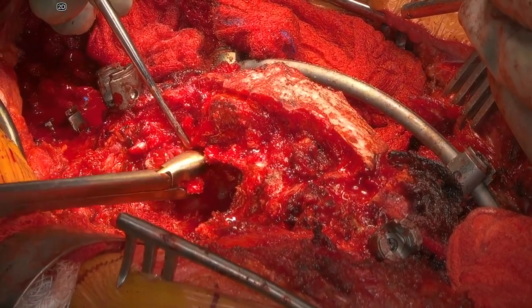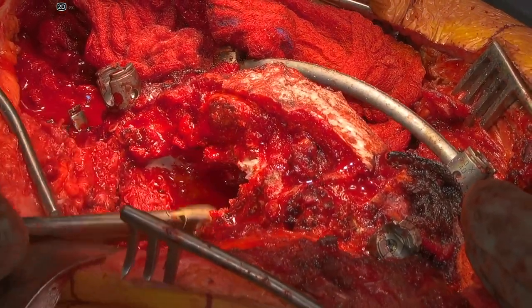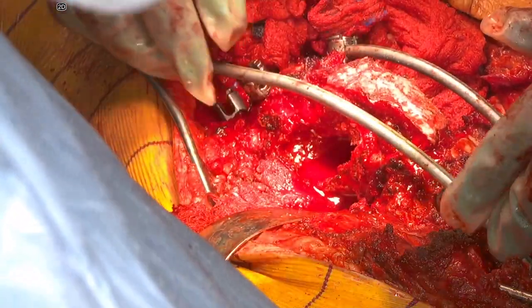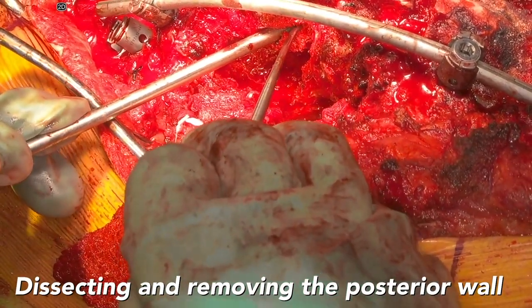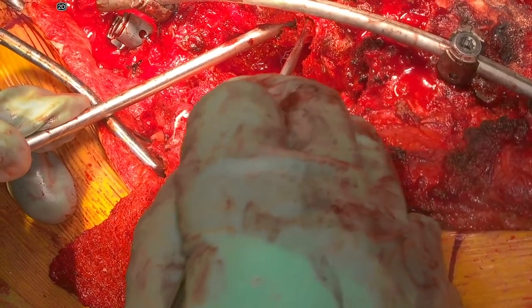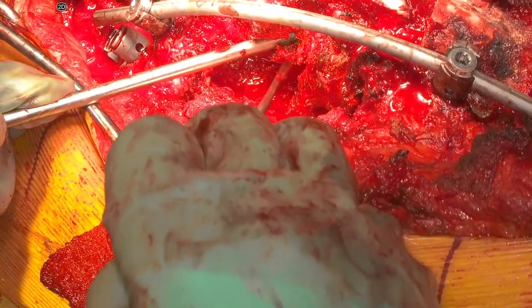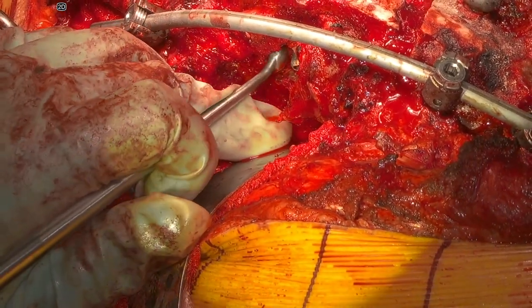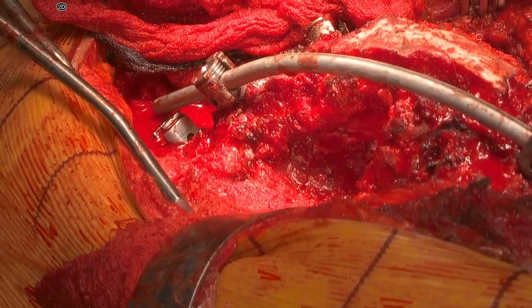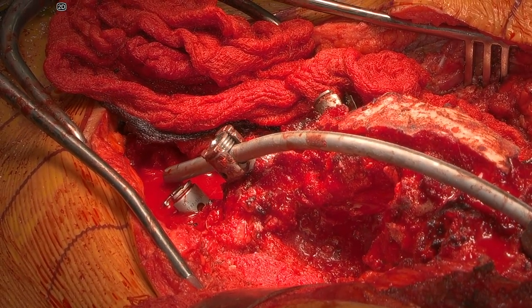Now the posterior wall is still intact, and the lateral portion of the posterior wall is removed with large pituitary rongeurs. The posterior wall is being dissected away from the dura so there is no adhesion between the spinal cord and the posterior wall. A down-going curette is used to push down the posterior wall away from the spinal cord. Any bony fragments or soft tissue are removed. Now one can see the pulsations of the dura with complete resection of all bone anterior to the spinal cord.